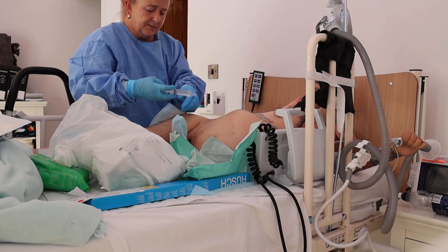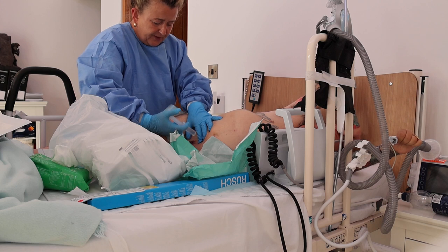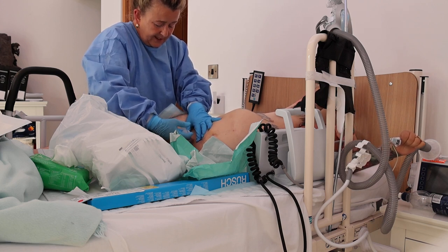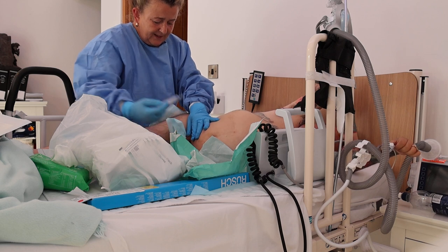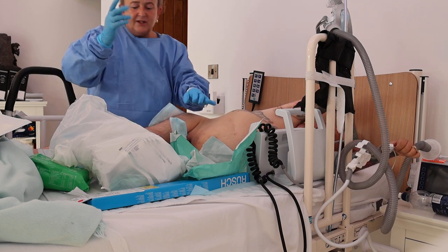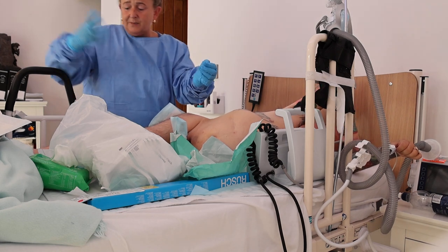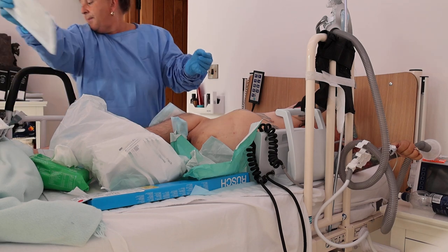It's in Instillagel, so what I'm going to do is put this in Instillagel, open up the stoma again, and just gently put some in. So it's an anaesthetising inside for him. As nicely, as gentle as you possibly can. Remember to check dates on everything. So that's ready, which is great. So now I can glove up again. I'm not bothered really about this hand because I'm going to need this to squeeze, but I do need one more glove.